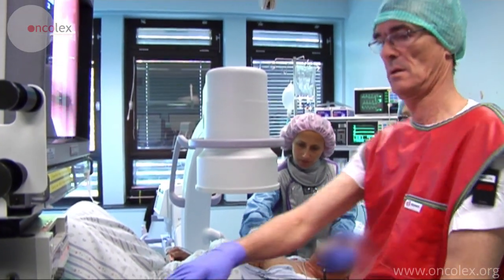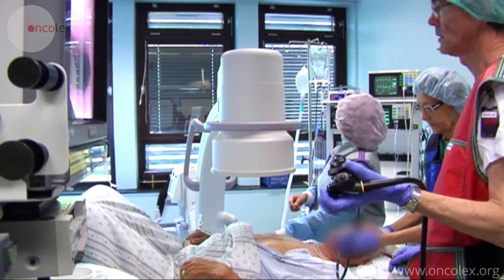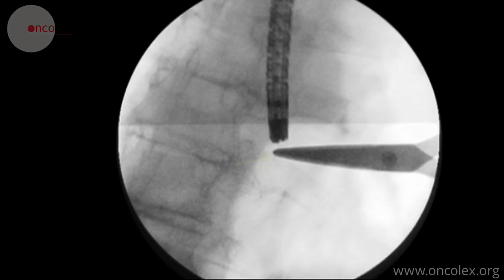To ensure correct placement of the stent, the upper and lower parts of the tumor are marked with lead balls, which are visible on the fluoroscope. Scissors are placed on the patient's chest, and when this area is x-rayed, the doctor can establish the correct placement of the ball. The scissors are here placed by the lower part of the tumor.